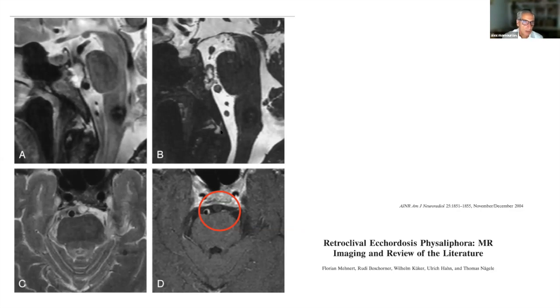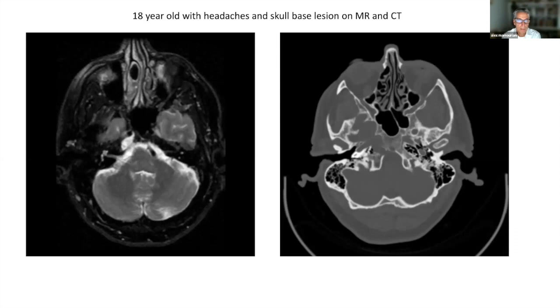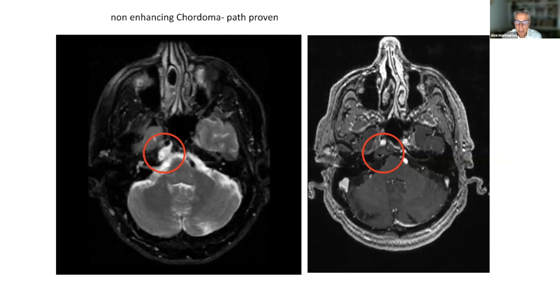Here is a more typical appearance of this notochord remnant — it lies in the cistern with a little attachment to the clivus and no enhancement after contrast administration. In a different patient, we have an off-midline mass with T2 prolongation and bony destructive change. It does not enhance. The off-midline location and bony destructive change should take you away from the notochord remnant; however, the lack of enhancement is not typical for a chordoma. Because it was changing over time, this went to surgery and proved to be a non-enhancing chordoma. So enhancement alone is not the only feature you can rely on.